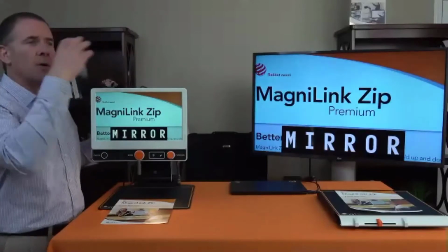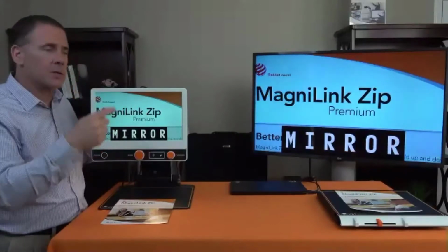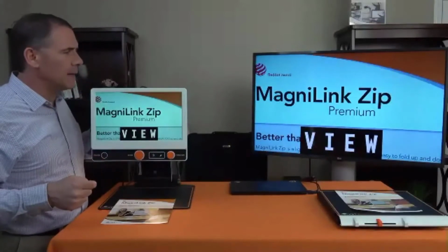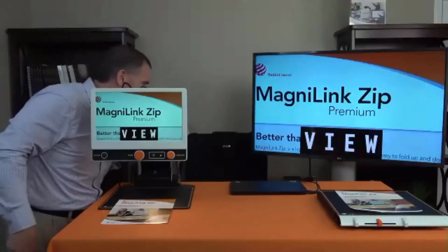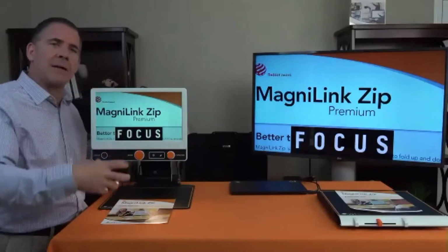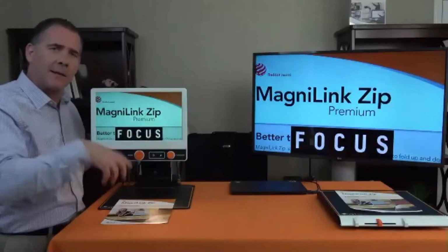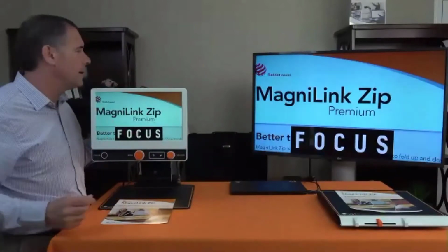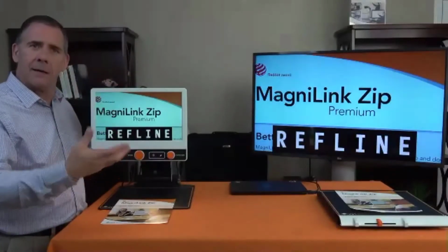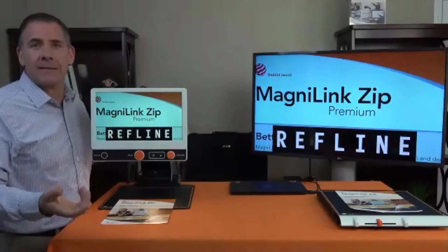If I rotate the camera around, I'm looking at myself, and I want to do something here, well, it'll show the opposite on the screen, unless I activate mirror mode. View is the brightness of the screen. I'm sorry, I couldn't see that well. Focus, manual focus. So if I have an object and I want to get down in it, like looking down a shaft, but I can't seem to focus it, I can manually focus it and get that part of the object nice and clear. Reference lines, I can put horizontal, vertical lines, and masking. So I can really adapt the screen, either one, to my reading style.